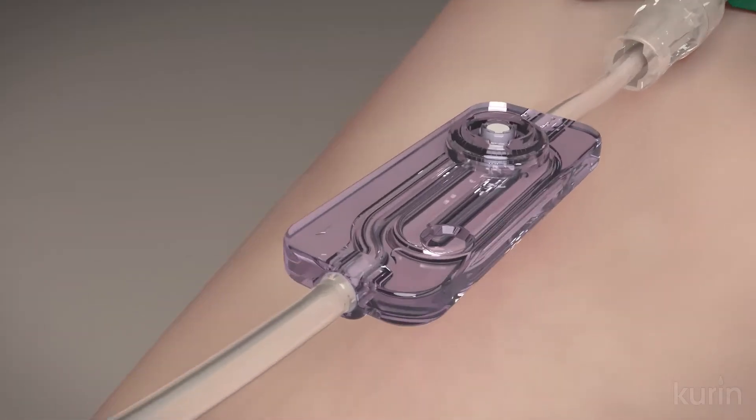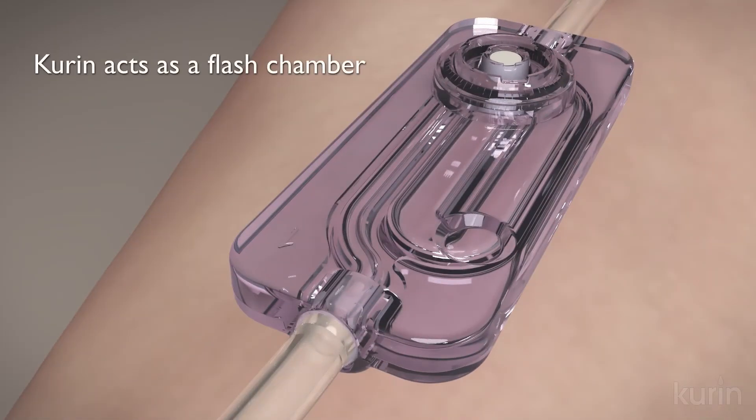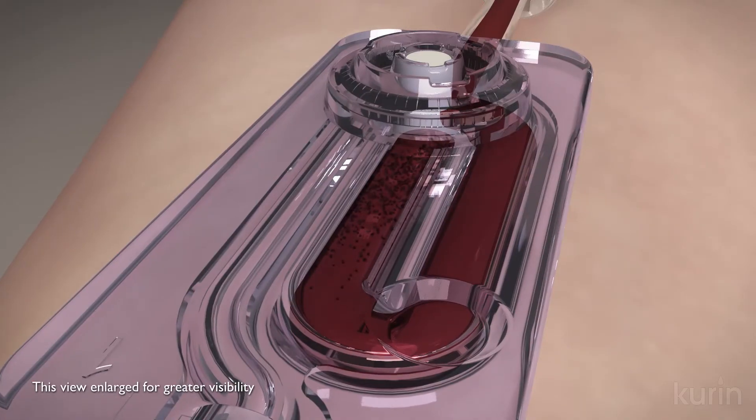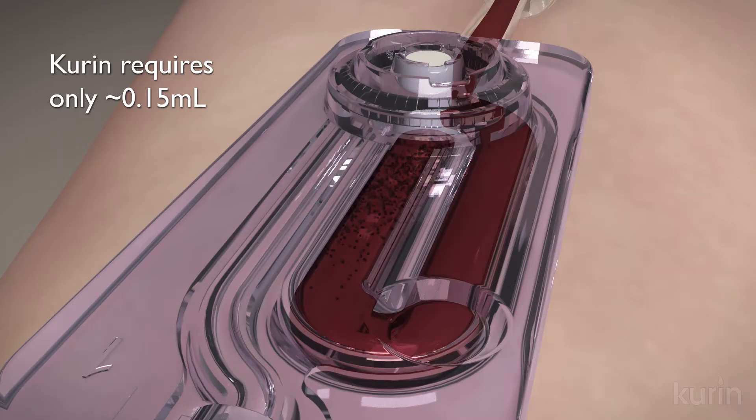With venous access, the initial flash of blood and contaminants within fills a U-shaped side channel until it reaches a white porous plug. Kurin requires only about 0.15 milliliters of precious blood, making the device ideal for peds and patients at risk for hypovolemic anemia.